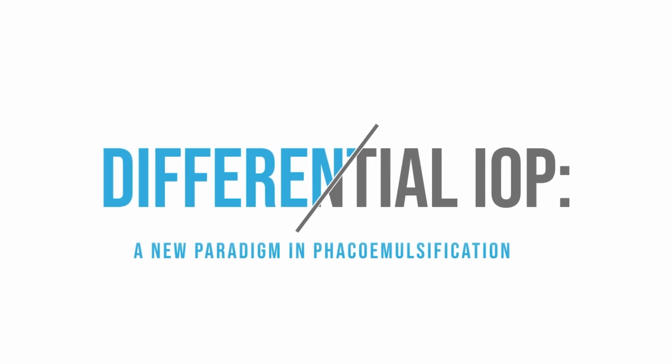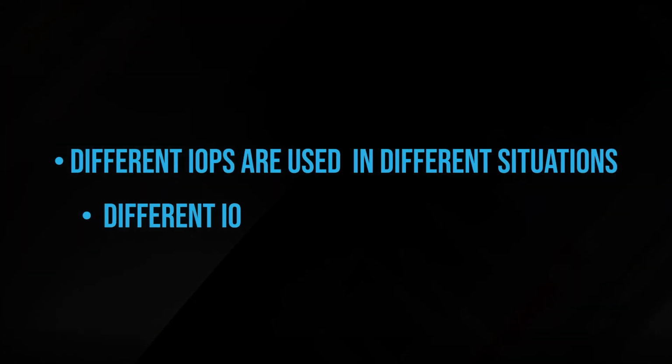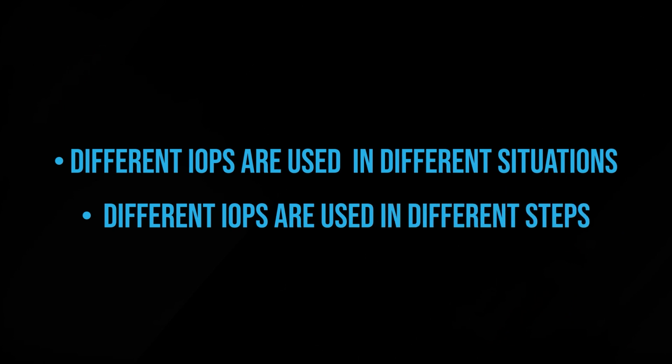Concluding, let's use a paradigm of different low IOPs, wherein different IOPs are used in different situations. Different IOPs are used in different steps to maximize patient outcomes.